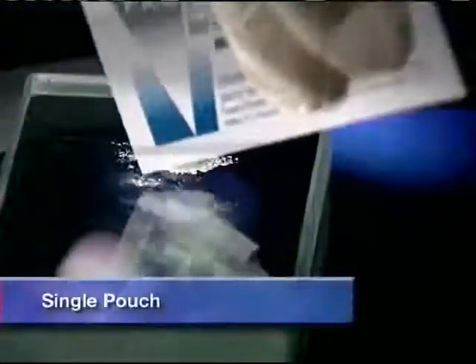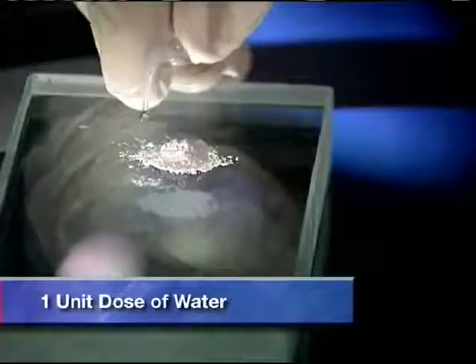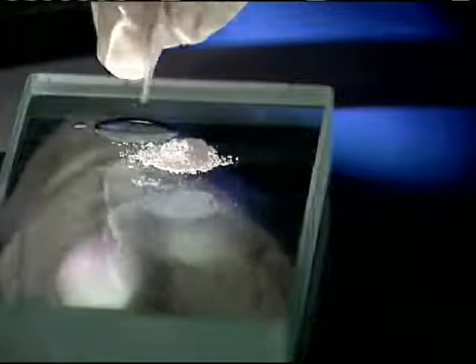First, open a single pouch of ProRoot MTA and dispense the entire contents onto a mixing pad. Next, cut off the end of a ProRoot MTA unit dose of water. Squeeze out the entire contents onto the mixing pad next to the dry ProRoot MTA material.